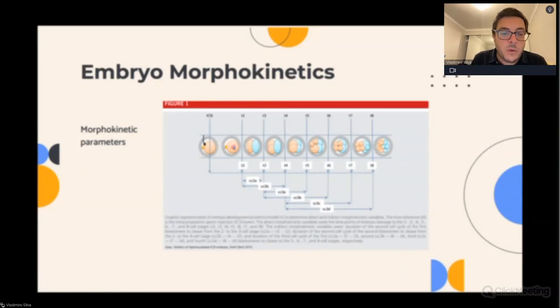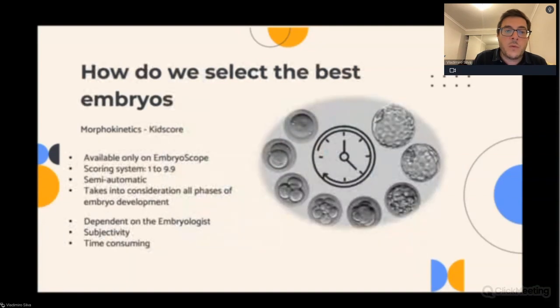Okay, so we started working with models in order to predict how the embryos work, and we could see that we started with the embryos that we knew that implanted, so what we call KID embryos, embryos with known implantation data, KID. And so we could see, well, if this one is implanted and we had a child born from this embryo, probably all of his characteristics are favorable.